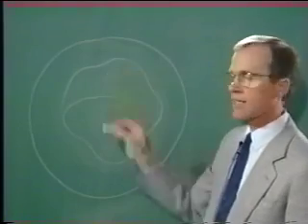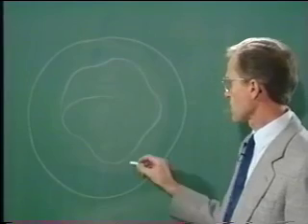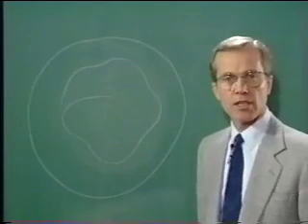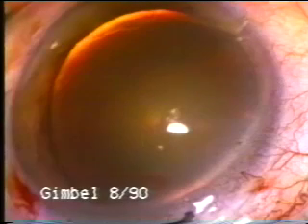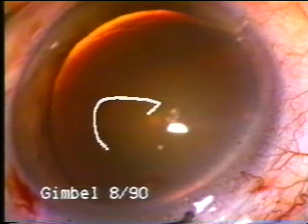So don't be dismayed by not getting a perfect circle — it will still be a good capsulorhexis. But as you get experience, you will find that your tear becomes a more and more perfect circle. On this surgical videotape, we will illustrate my method of continuous curvilinear capsulorhexis using forceps and cystotome: starting with the cystotome to make a central puncture, carrying it radially, then counterclockwise to finish at the point where the radial tear turned circumferentially.